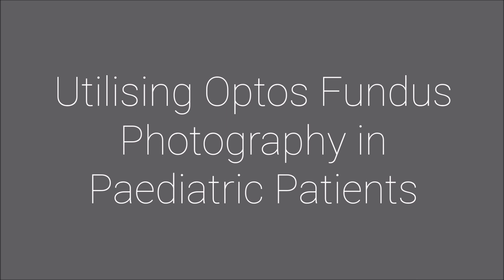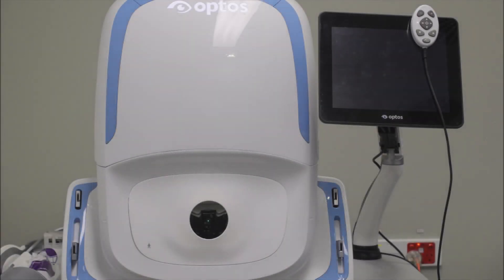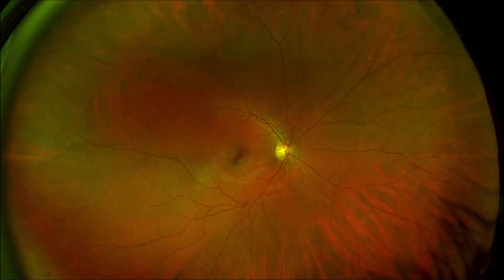This video will demonstrate the specific techniques and positions required to utilize Optos fundus photography in paediatric patients. It has seen greater use in kids because it can capture a high resolution 200 degree view of the retina in a single shot and in less than half a second.